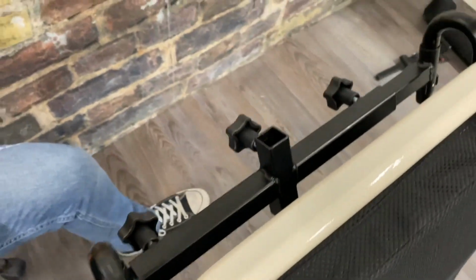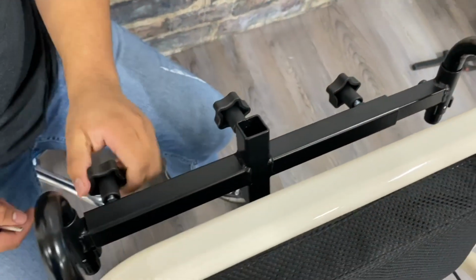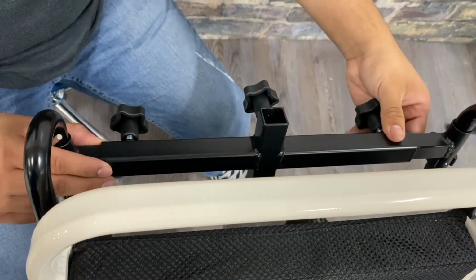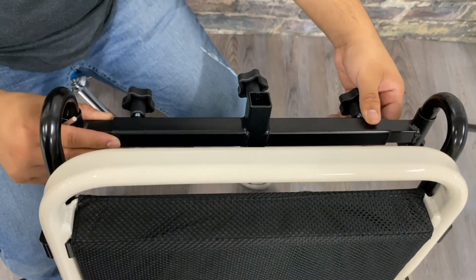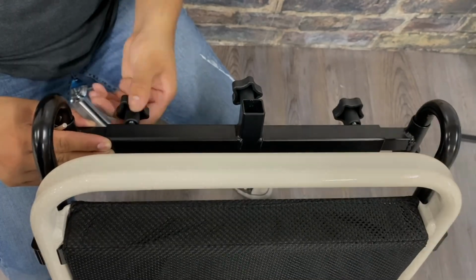Now, loosen up the two bolts on either end of the crossbar, and you can center that in between the U-shaped bars. You can also put it to one side or the other depending on your needs. But this is another adjustment point of the headrest itself.